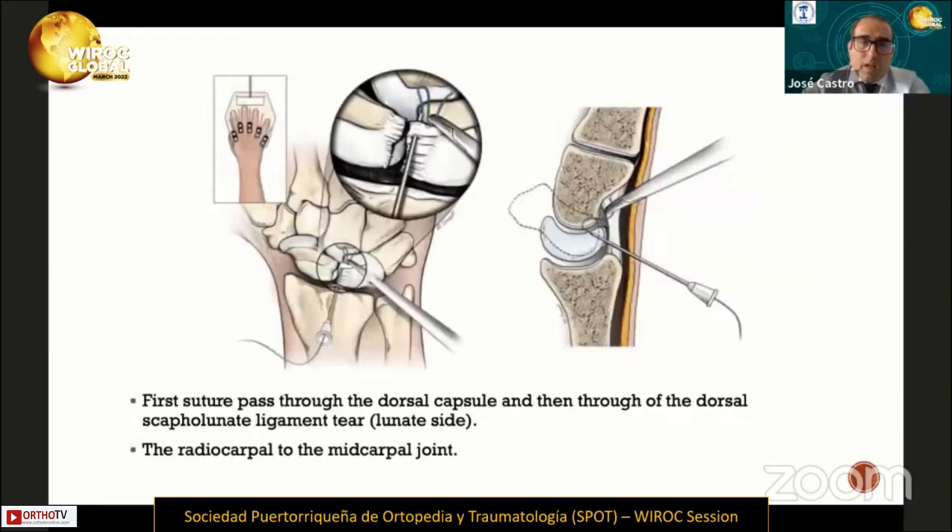In this technique, they use PDS sutures with needle number 21. The first step consists of passing the suture through the dorsal capsule and then through the dorsal scapholunate ligament on the lunate side. This suture passes from the radiocarpal joint to the midcarpal joint.